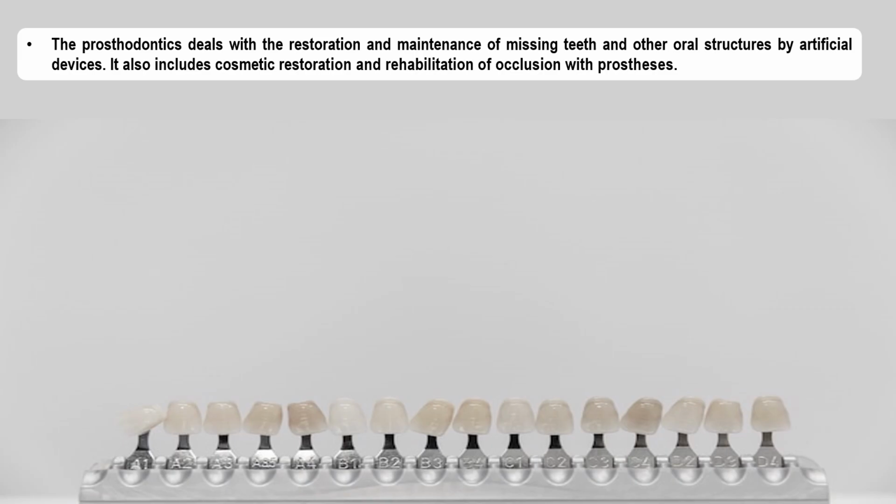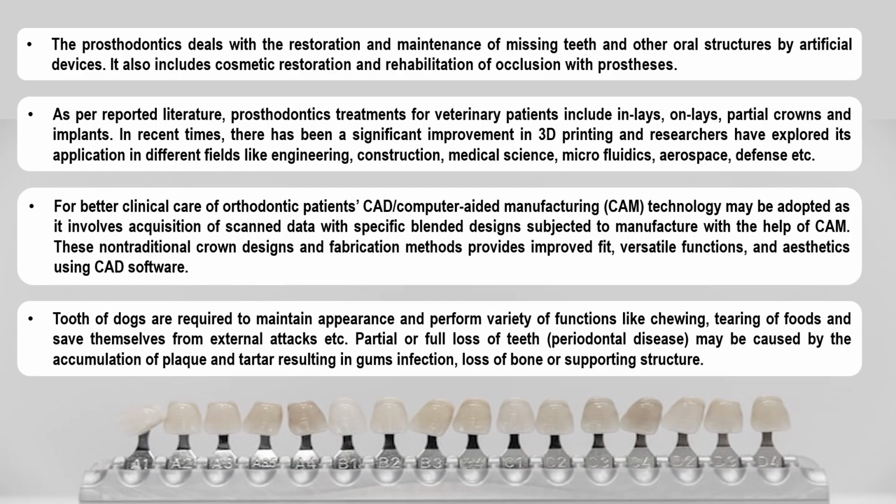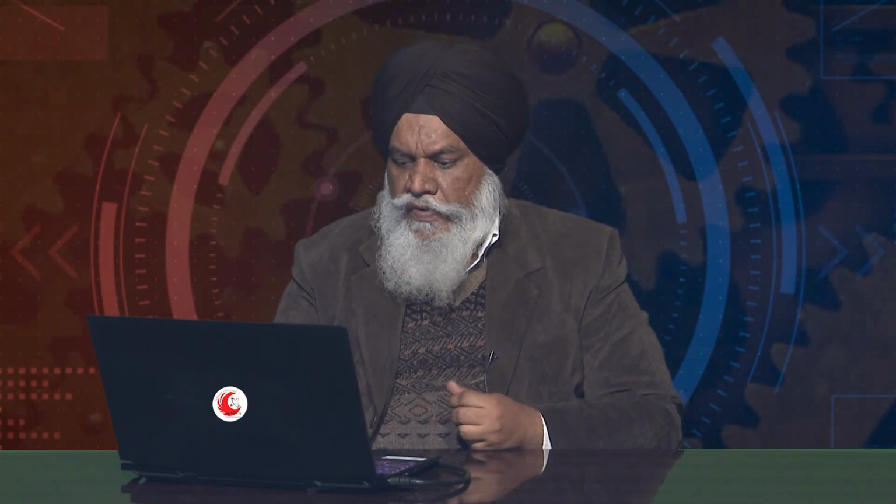Till now we have seen the use of 3D printing for numerous applications, which involve mechanical manufacturing, the area of joining, and the area of orthopedics. Now, this particular example that I am going to share in this case study is on the use of 3D printing for development of a strategic tooth for a canine. In this case, we are interested in pre and post processing parameters optimization using FDM 3D printing for the development of strategic tooth crowns in the case of a canine.